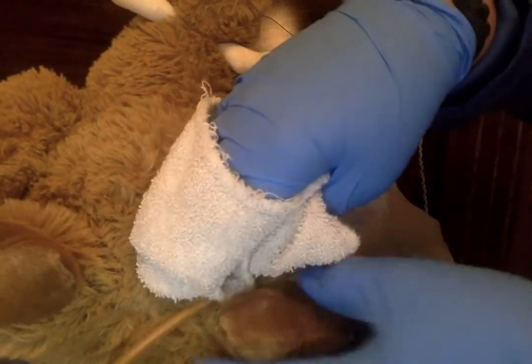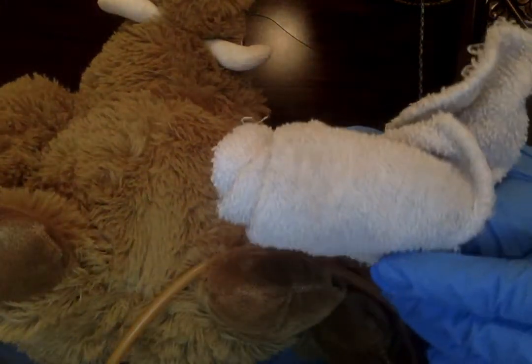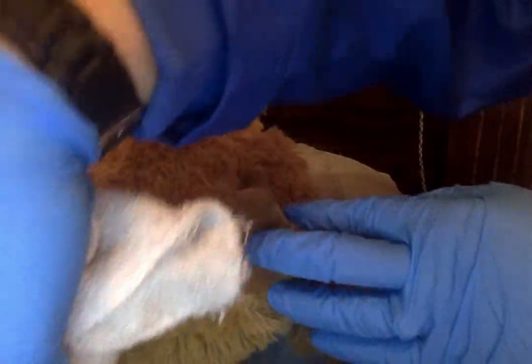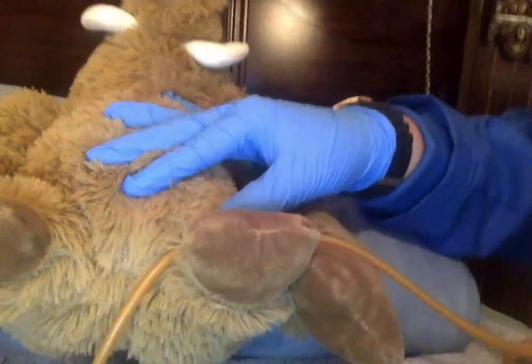We're going to come over here and we are going to clean this side, switch sides of the towel, clean the other side, switch sides of the towel, go down the middle. Okay, and now our peri-care has been performed.